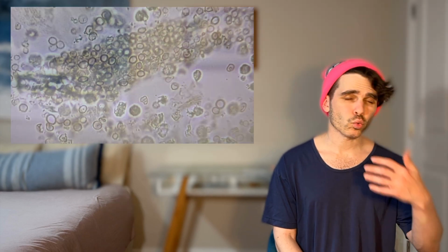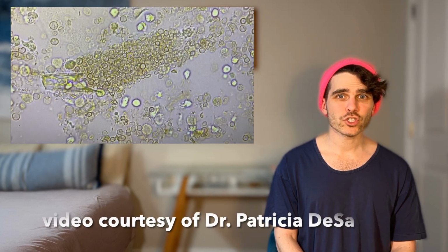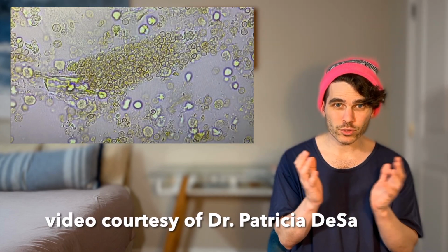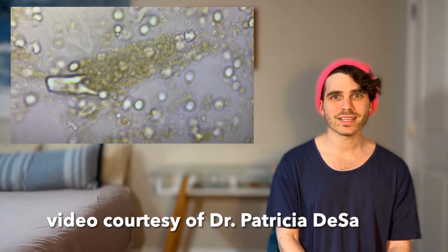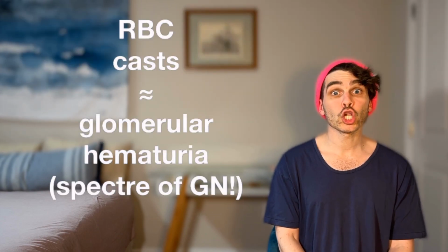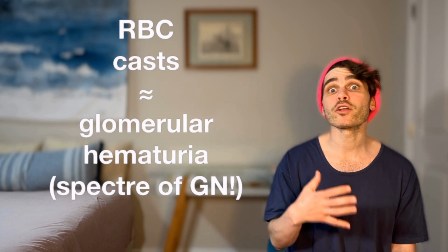You can have red blood cell casts in which some red blood cells have been trapped inside of that glycoprotein uromodulin matrix. Classically, we like to think of this as another clue of a glomerular hematuria. And then you could have white cells inside of that cast matrix, and we would call that a WBC cast.